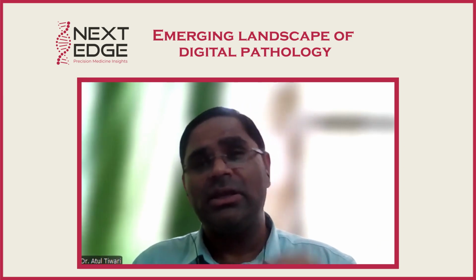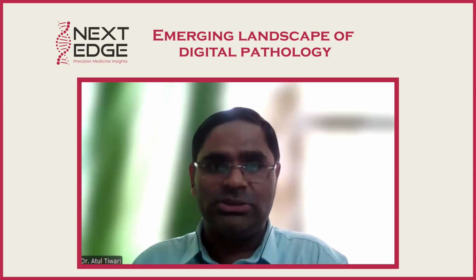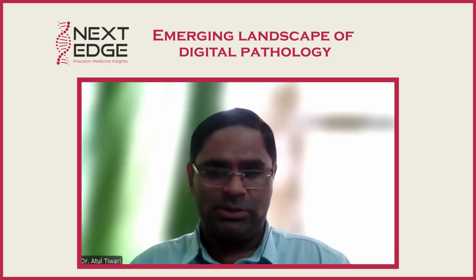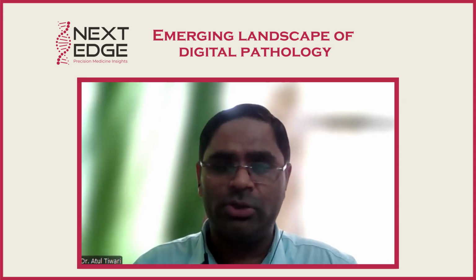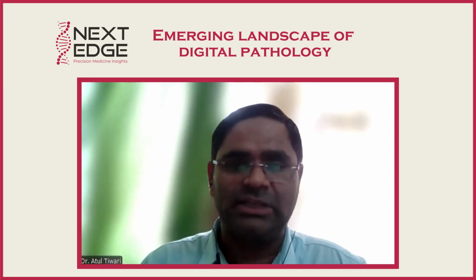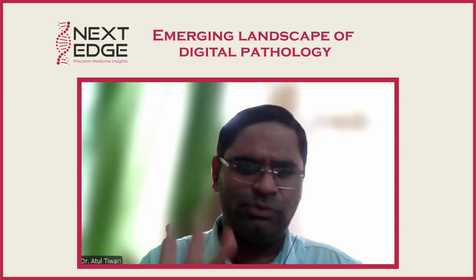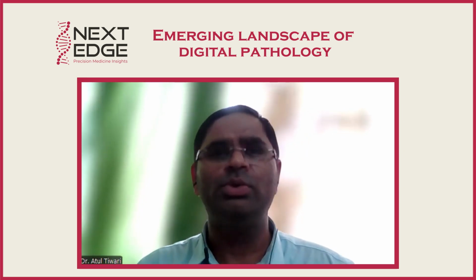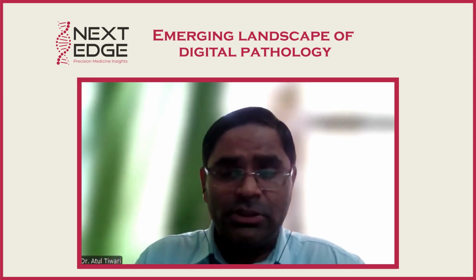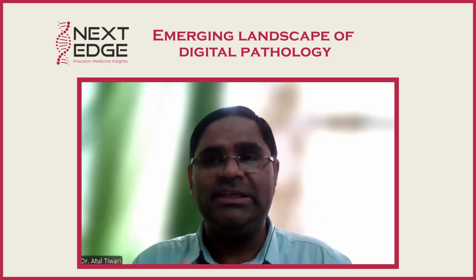So if I talk about AI in pathology, 70 to 80% of tasks are related to glass slides in a decent lab. I'm not talking about the molecular pathologists. They are doing work at a whole next level. Their glass slides are not there, but other things are there. AI is applicable for that also. But for today, we will discuss the routine pathologist work that we do in most labs. So we work on glass slides. So in a glass slide, what is there? If I see through a microscope, I see an image.